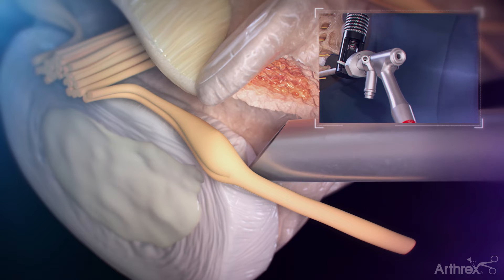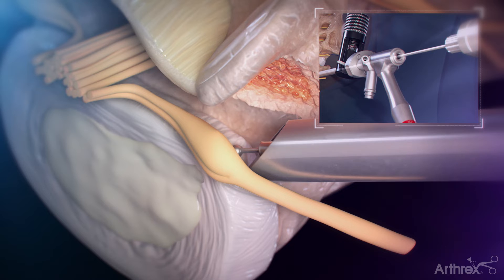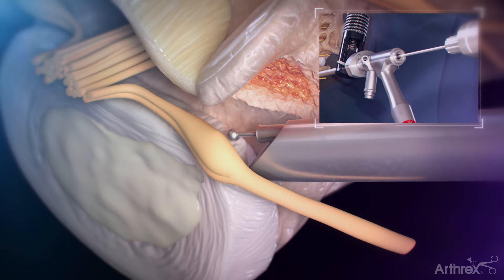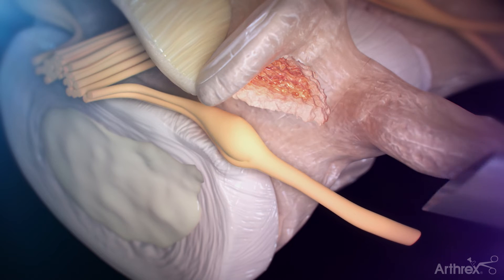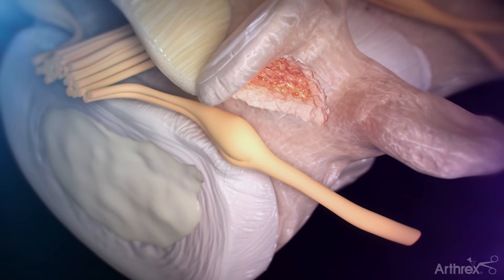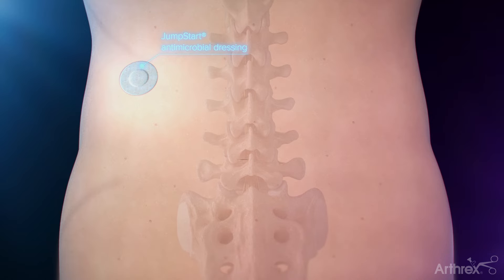Once the herniation has been removed, the surgeon will use small instruments, including a ball-tip probe, to explore and ensure all disc fragments have been removed. After removing the cannula and endoscope, a stitch or two may be used before a small bandage is placed to close the incision.